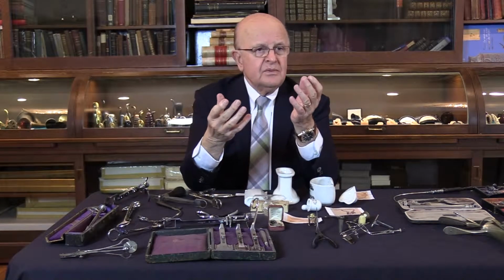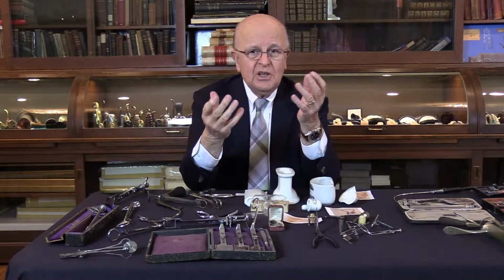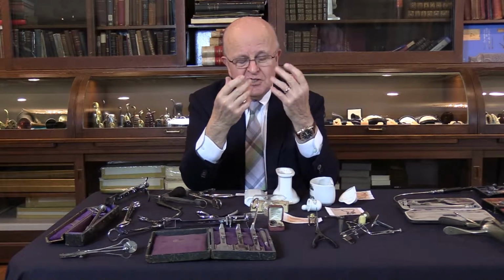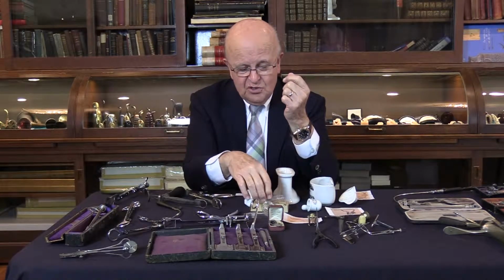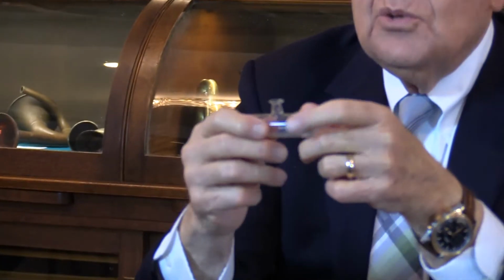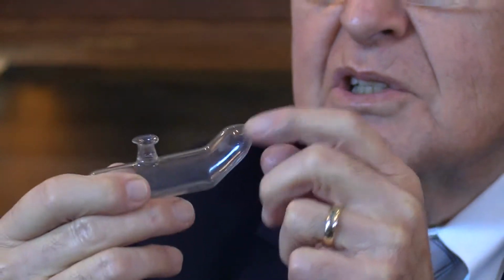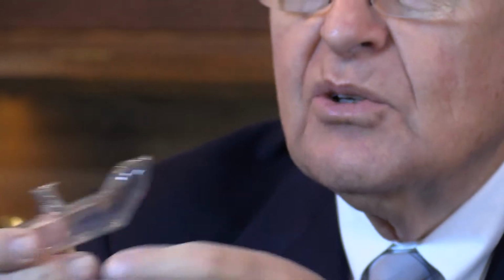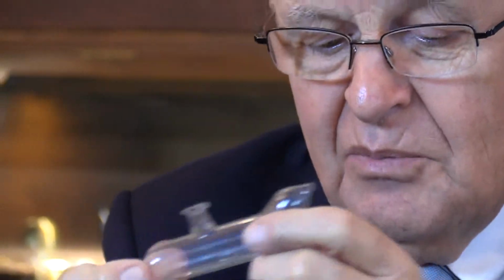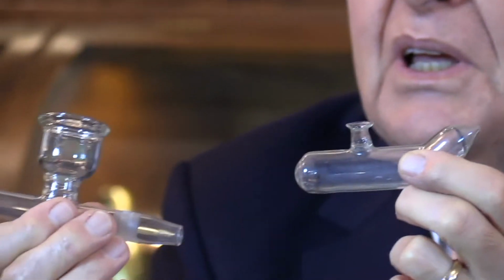As in present day, physicians and patients believed in nasal irrigation. So they had the so-called nasal douche. And this came in a box like this. And you put the saline or whatever solution here, and then you inhale it. You suck it in through one side or the other side of the nose. It came in this shape or other shapes like this.